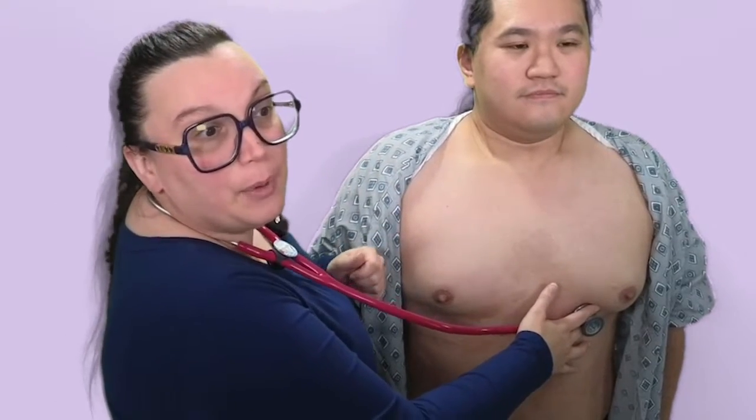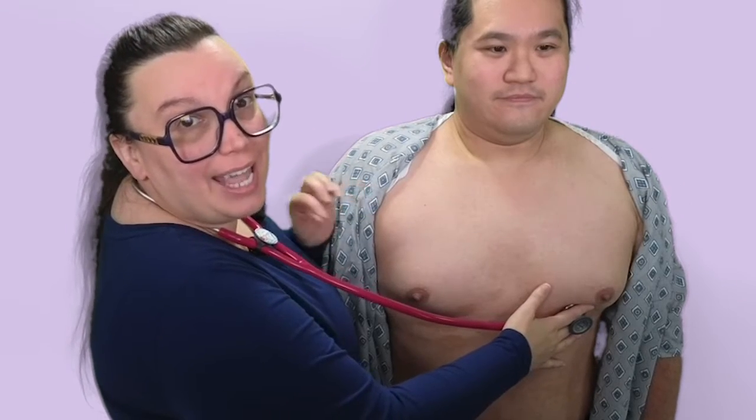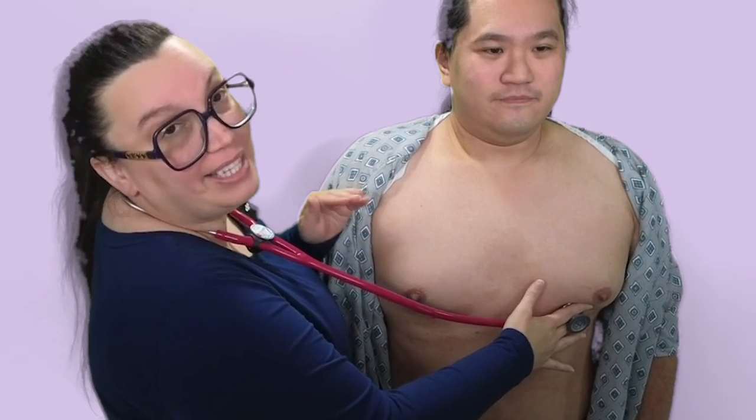This is where the apical pulse is best heard. If we need to give medications like cardiac glycosides — also known as digoxin — you want to listen to the apical pulse counting for at least a full minute when giving these kinds of medications. In adults, a normal apical pulse should range between 60 to 100 beats per minute.